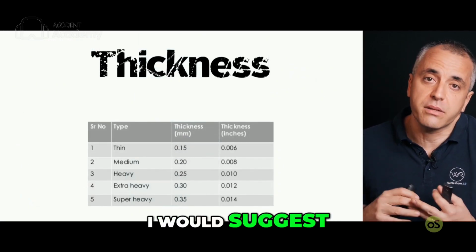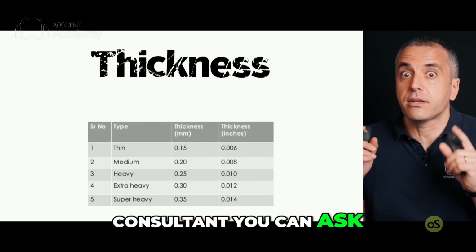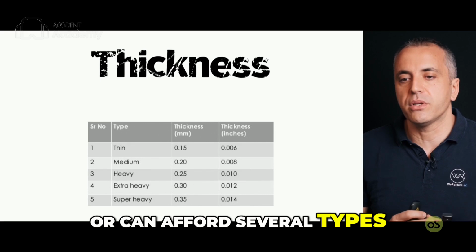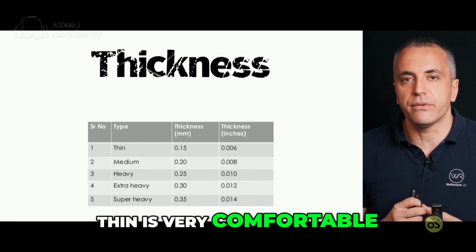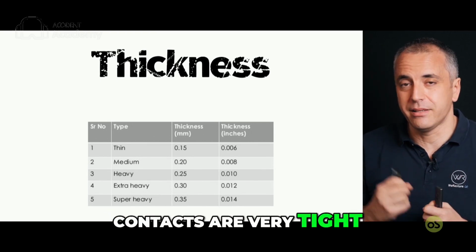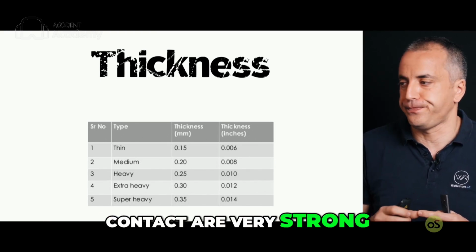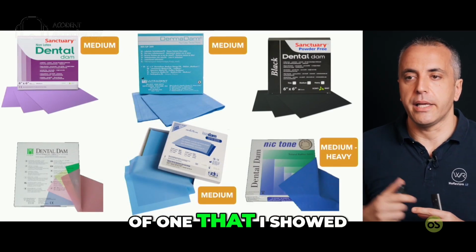I would recommend, if you want to choose, maybe you are a consultant, you can ask for just one single rubber dam, ask for a medium one. If you can ask or can afford several types, ask for medium and heavy, and why not also thin. Thin is very comfortable, for example, when the interdental contacts are very tight. So you need the thin, and there is no lubricant sometimes that helps you when the contacts are very strong. These are the medium ones that I showed.